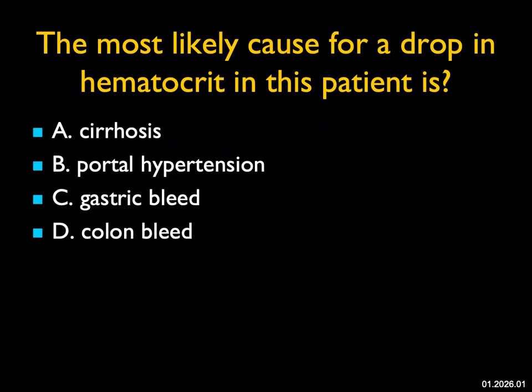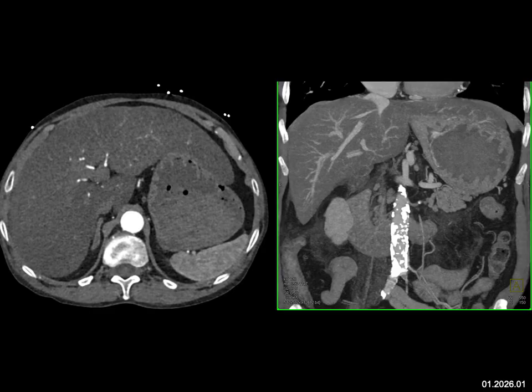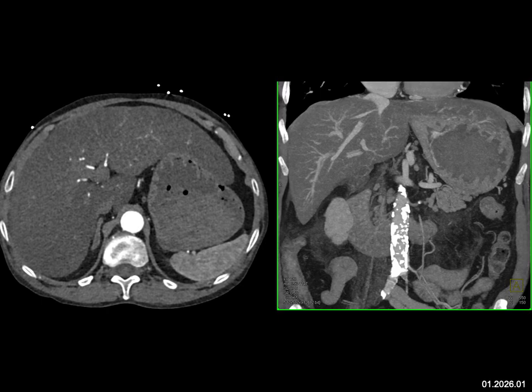The most likely cause for a drop in hematocrit in this patient: when you look carefully, you see cirrhosis of the liver with fatty infiltration. You then see thickening of the gastric folds, and the fluid in the stomach is high density. On the coronal view, there's an area that's very bright. That's a bleed in the stomach. The patient has cirrhosis and portal hypertension, but that's not the cause of the bleeding — it's an ulcer in the stomach. There's no colonic bleed seen here.